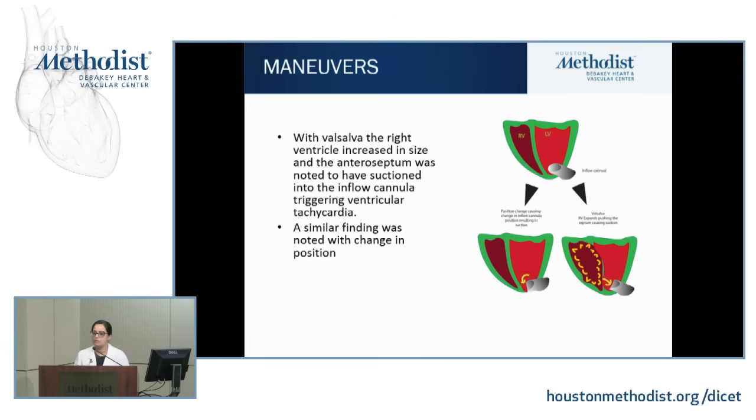But this is a kind of my understanding of it. Somebody told me it looks like watermelon, but this is the septal interaction. If you have an inflow cannula, if you have change in position, I do think that with change in position, inflow cannula can change. And the other thing that can cause a change in overall inflow cannula position long term is change in weight. So that's one thing to look for. And then the other thing is, if you do Valsalva, then that can cause dilation of the RV, and that interaction can also illustrate suction events. So if you're really wondering if somebody has suction or not, make them do the change in position and enact whatever they think it does cause VT.